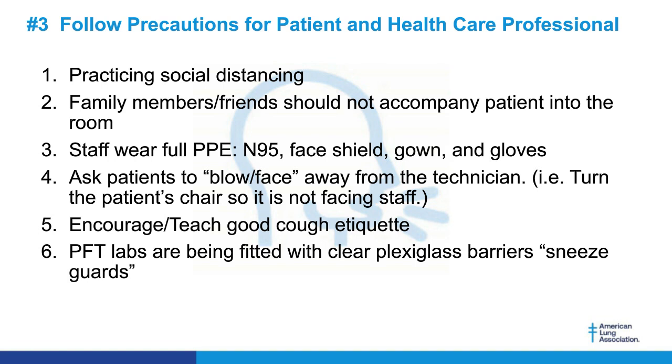We're encouraging and teaching good cough etiquette. We have a big poster in front of each patient that shows cough etiquette, and we have tissues ready for the patients right in front of them. We're also fitting all of our PFT labs with clear plexiglass barriers, also known as sneeze guards.